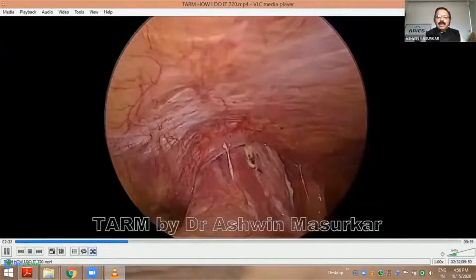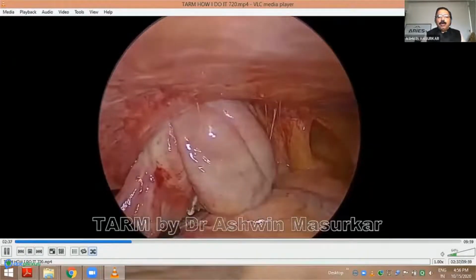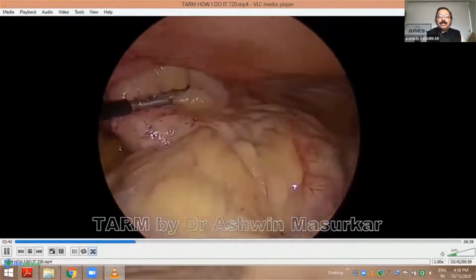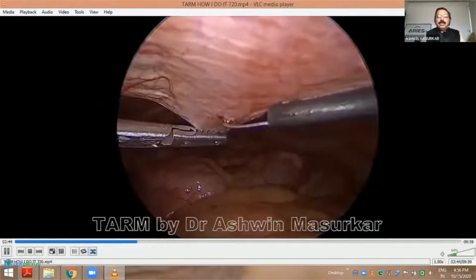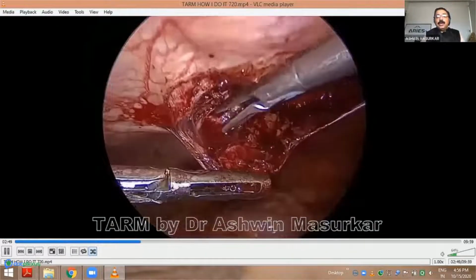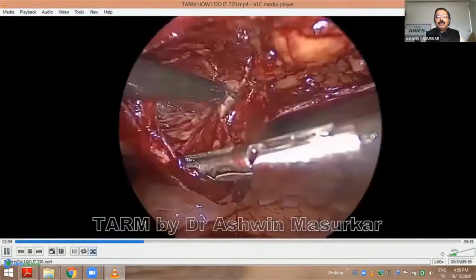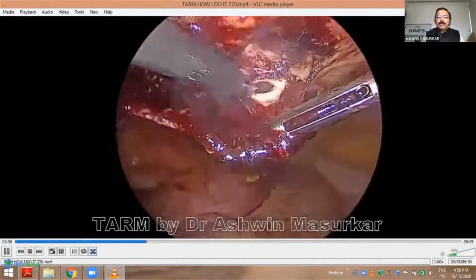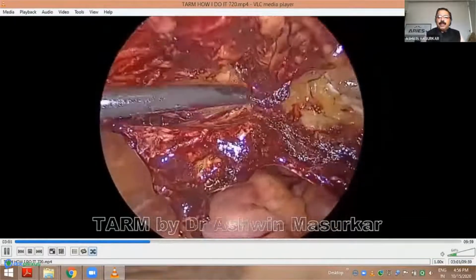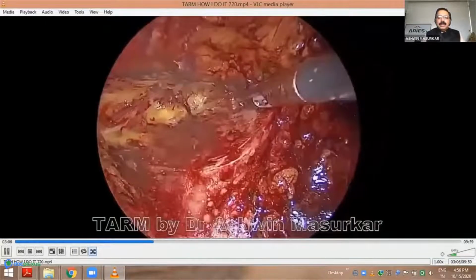This is the greatest advantage of approaching a ventral hernia transabdominally rather than extraperitoneally. When you have an obstructed hernia or you have bowel inside, you're always unsure about how you're opening the sac. So here you can open the sac under direct vision. You can reduce the contents under vision. You can look for any Swiss cheese defects, and you exactly know what is happening because you're dealing with this hernia from the point of origin and not one plane ahead as you would do extraperitoneally. And this is a very wide working space, so anatomy is very nicely demonstrated here.